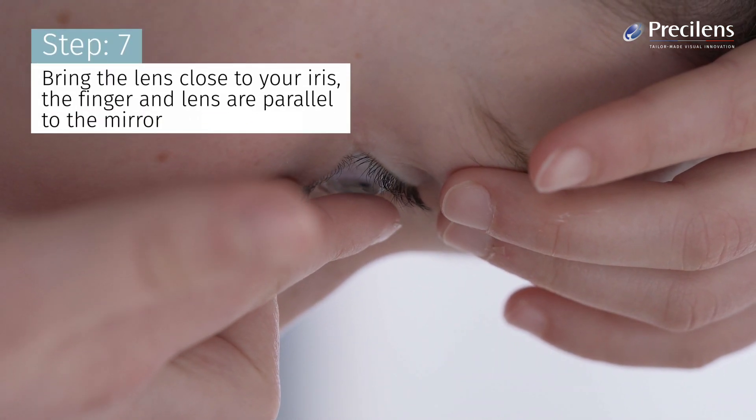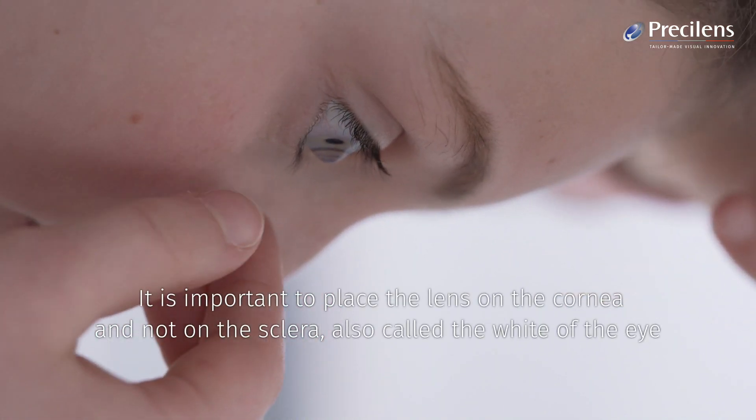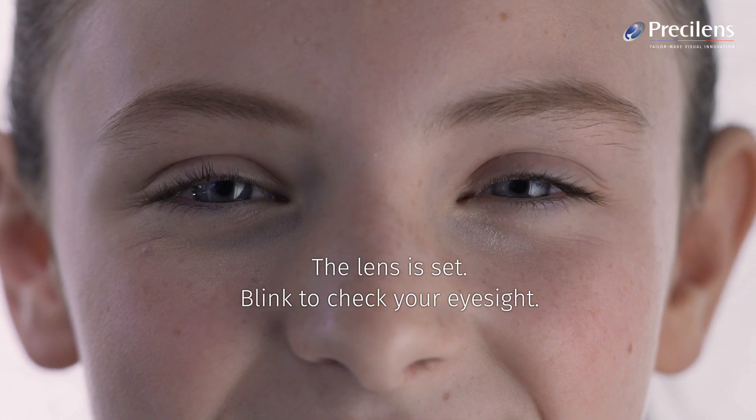Bring the lens close to your iris, with the finger and lens parallel to the mirror. It is important to place the lens on the cornea and not on the sclera, also called the white of the eye. The lens is set. Blink to check your eyesight.